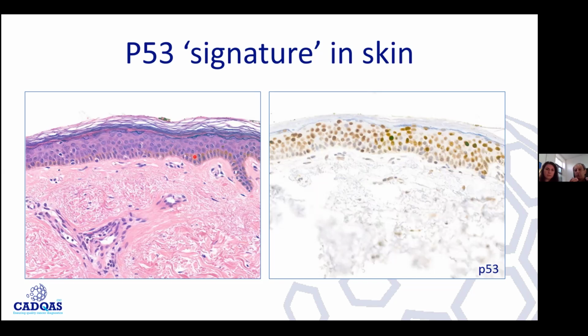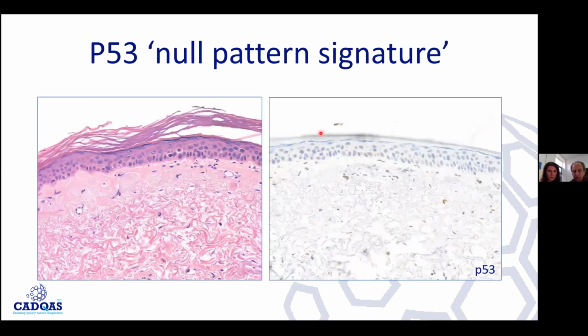Actinic keratosis goes from the basal cell downwards and buds into the dermis, whereas Bowen's disease colonizes the epidermis. They are two different diseases of dysplasia of the squamous cells. This is a bit debatable. Morphologically, there's this odd hyperkeratosis, and one might argue that this is dysplastic. And this was a null pattern, which Corrado already mentioned, when you have absolutely no staining.